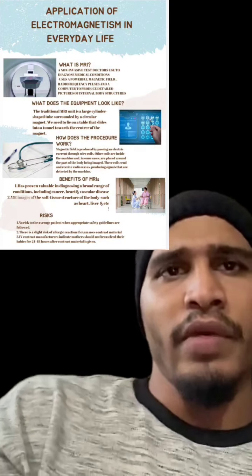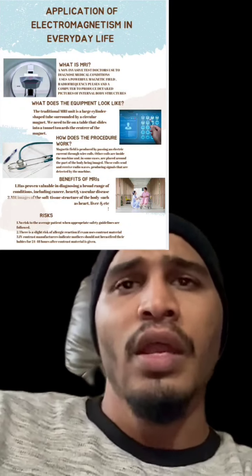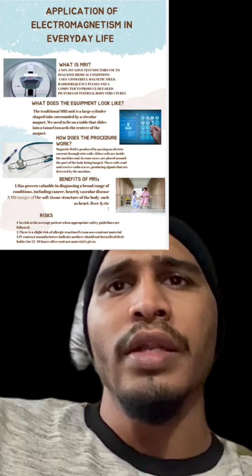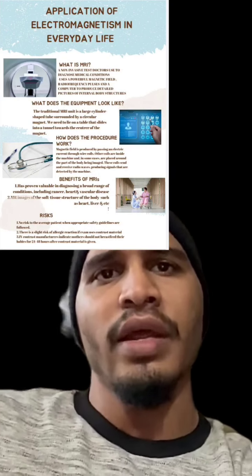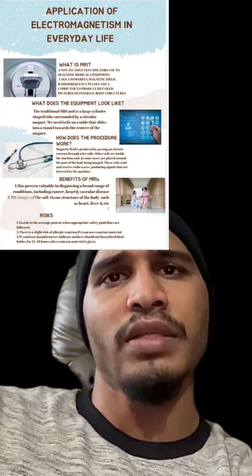What is MRI? MRI, magnetic resonance imaging, is a non-invasive imaging technology that produces three-dimensional detailed anatomical images. It is often used for disease detection, diagnosis, and treatment monitoring. It is based on sophisticated technology that excites and detects the changes in the direction of the rotational axis of protons found in the water that makes up living tissues.